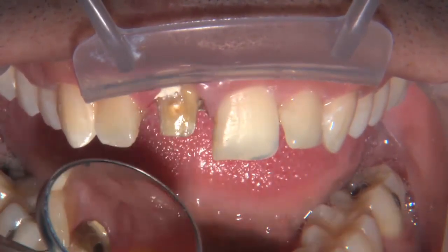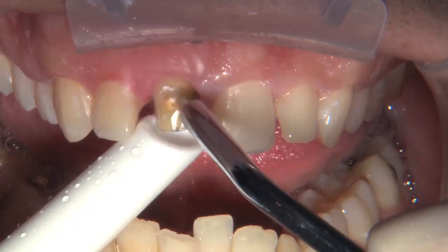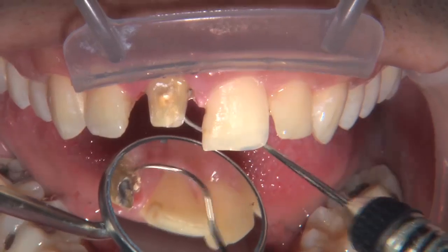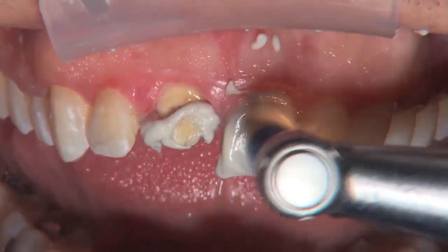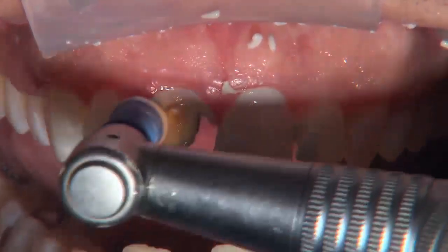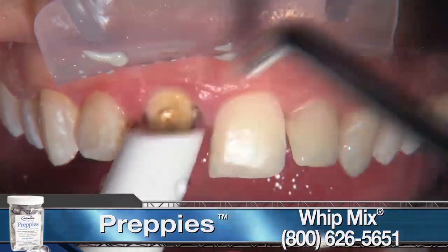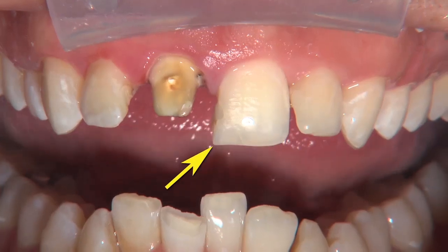It's been about six days, and we're going to take off the temporary, clean things up, and try on the restorations. There's a little temporary cement stuck right on that spot where the gold buildup was, so we're making sure to clean off all the excess temporary cement. Sometimes we'll do it with a sonic scaler, especially if we used Duralon as a temporary cement — we want everything nice and clean because that's one of the main reasons crowns don't seat completely. We tried in both restorations, the patient liked how they look, so we're jumping ahead to cementation and bonding. That's the Preppies Pumice from Whipmix — I love it because it's disposable, used once and tossed away.